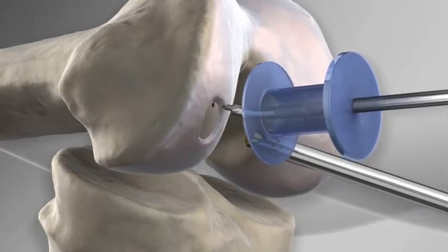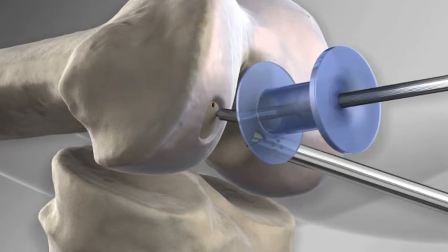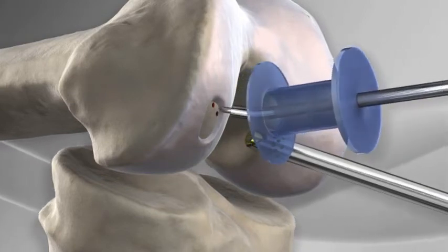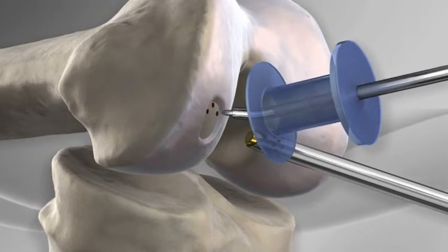The pick is used to punch small holes in the bone where the lesion is located. These holes allow blood from inside the bone to cover the defect.